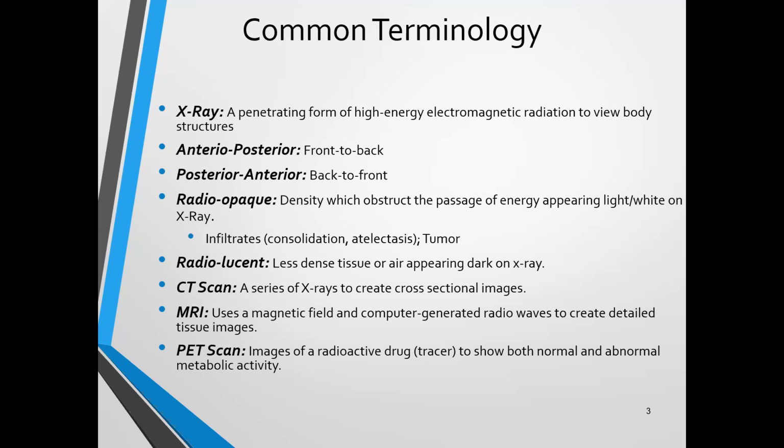One of the advantages to a PA versus an AP X-ray is just much less tissue between the skin surface and the lungs. And again, the main focus of this presentation, when we're talking about chest imaging for neonatal and pediatric patients, is really we're not really looking for trauma per se. We're really looking for other forms of pathology. So AP versus PA.